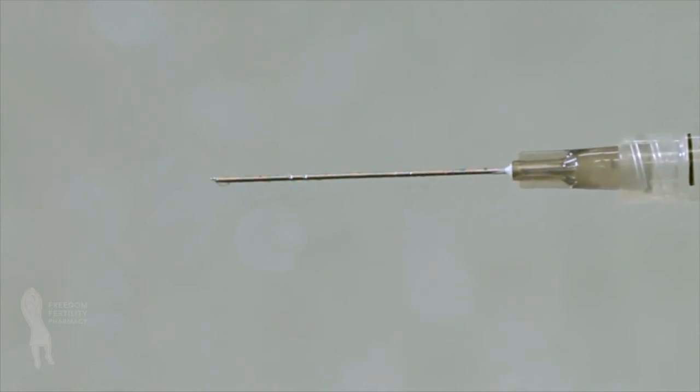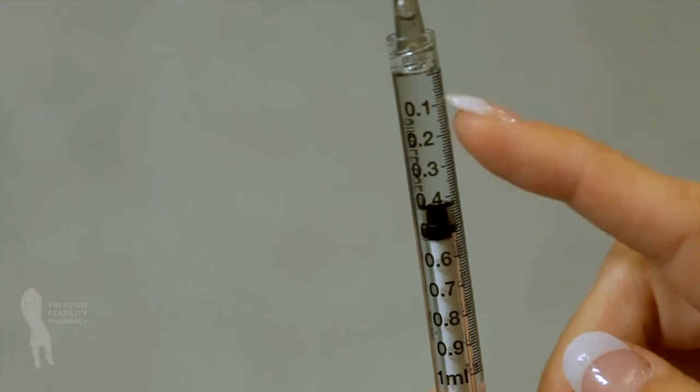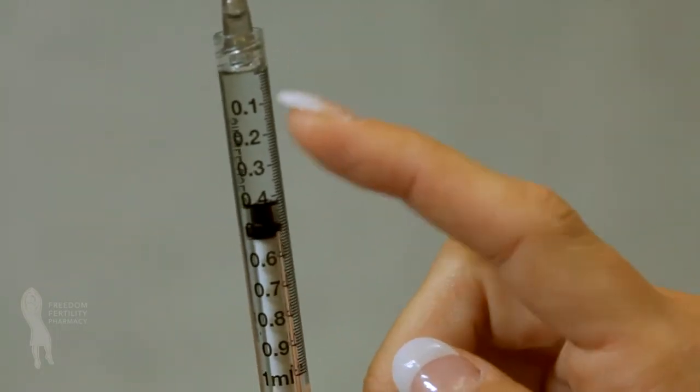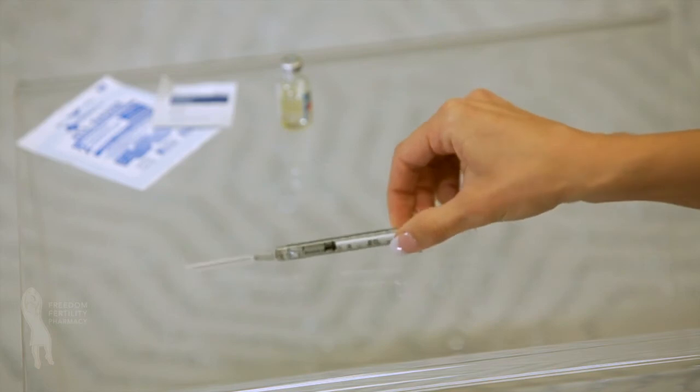To remove any air bubbles in the syringe, point the needle upward and gently tap on the syringe. When all bubbles have risen to the top, slightly press on the plunger until a small drop of solution appears at the tip of the needle. Recap the needle.